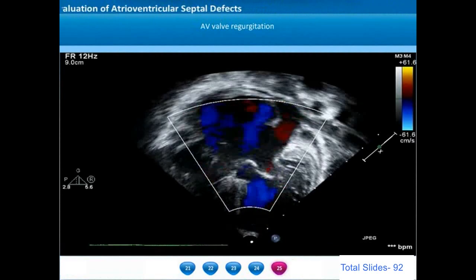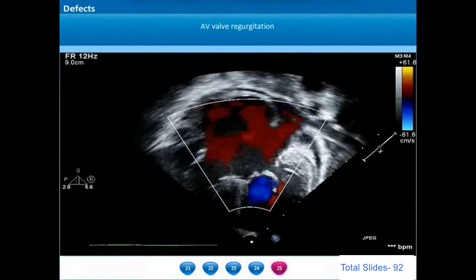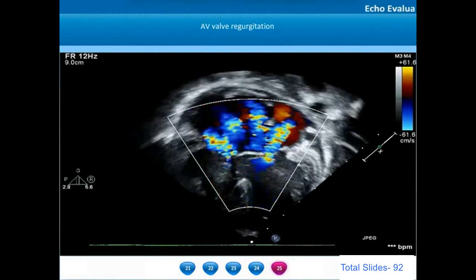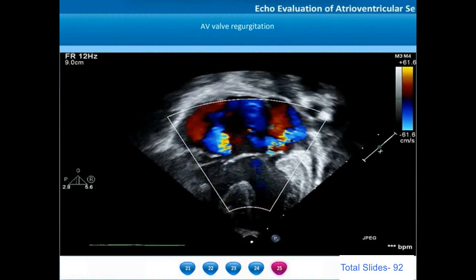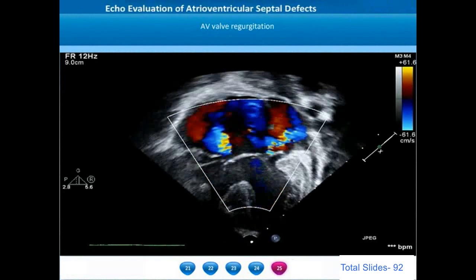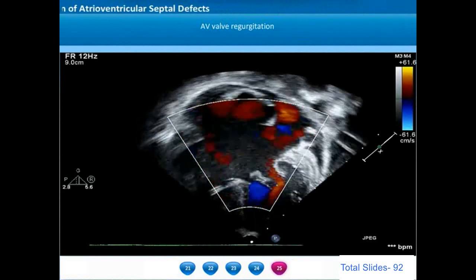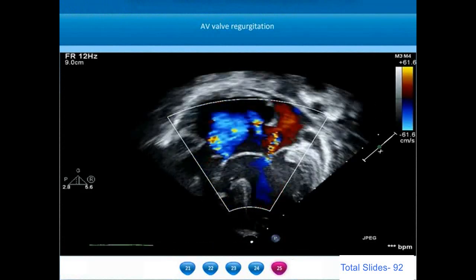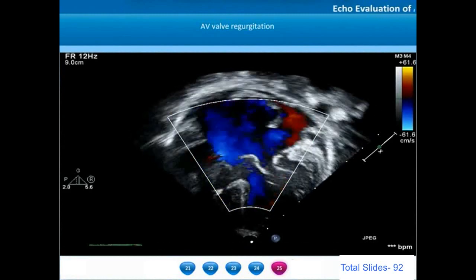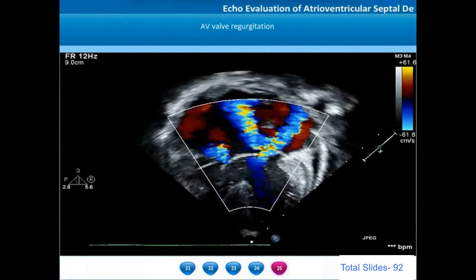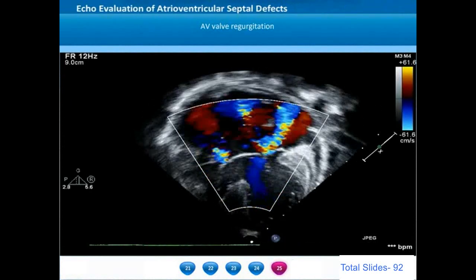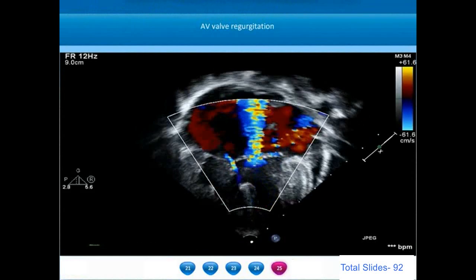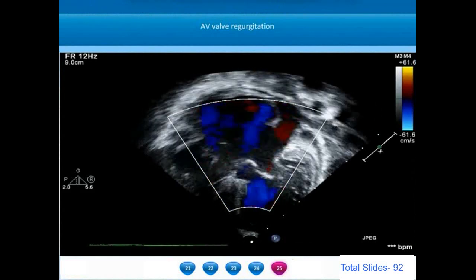Assessment of the location of AV valve regurgitation is important during repair. In this example, the AV valve regurgitation appears on the left-sided component in two jets: one between the left mural leaflet and the inferior bridging leaflet, and one between the superior and inferior bridging leaflets. There is also a milder component between the right anterior and right posterior leaflets. Carefully analyzing all individual jets and their points of origin indicates the location of the regurgitant orifice in the large common AV valve.